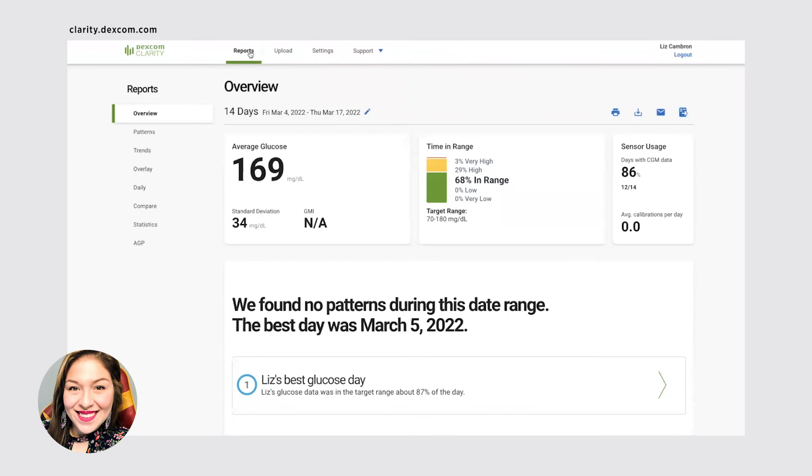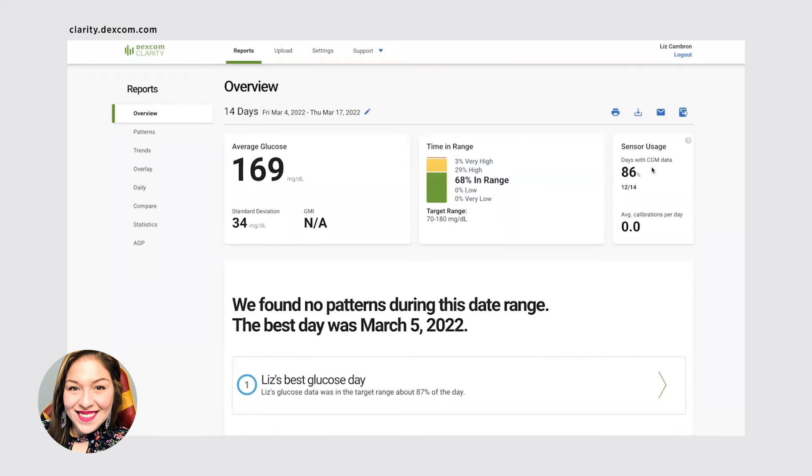The home screen will show you your report overview. So for the past 14 days, what your average glucose was, what your standard deviation was, again, that's plus or minus what your average is. So my highest was about 190. And my lowest was about 130. It shows you your time in range, your sensor usage. So how many days did your continuous glucose monitor actually receive information? And it'll also sometimes show you patterns.